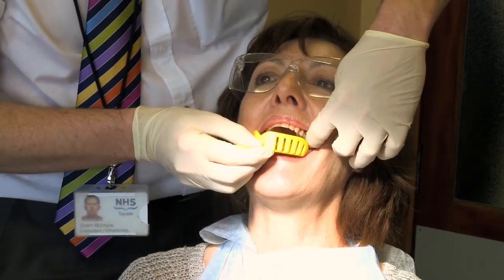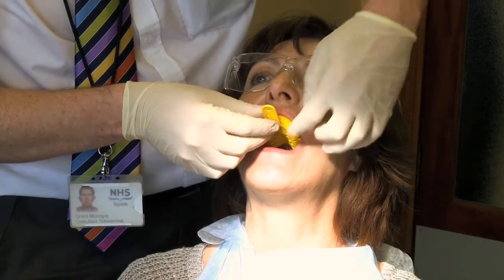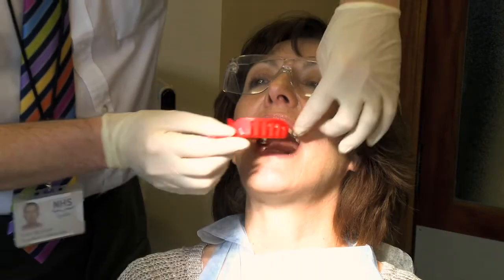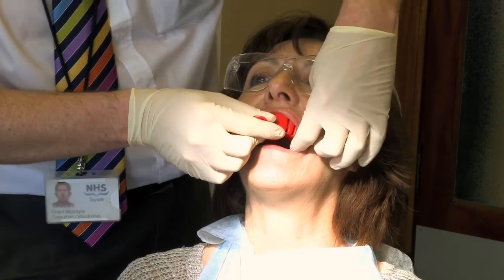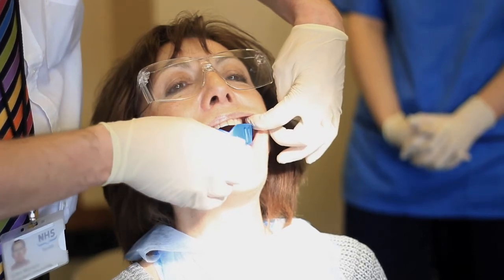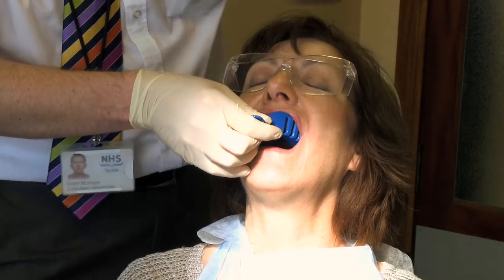So we'll start with the small one and see if we can stretch it in here. But that definitely feels too small to me, so I think we should take that back out and try the middle size. Again, you'll stretch your cheeks and try and fit it in as neatly as possible. And that looks like a perfect fit, that one, but again we'll just try the large one to make sure that it probably is too big. Yes, that definitely feels too big to me and probably to you as well.